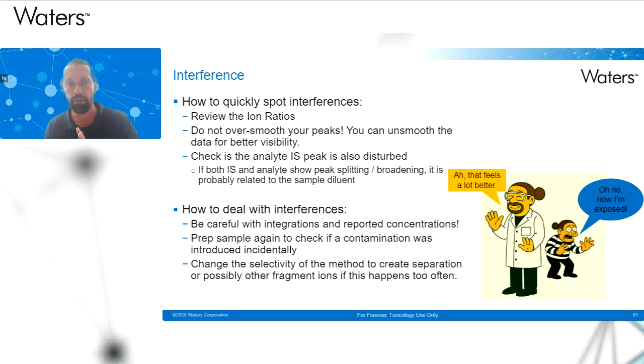So how can we deal with this? What we saw in the previous slide is that the internal standard was actually looking very nice. So it's always good to also compare the peak shape of your analyte with the peak shape of your internal standard. But then if we do observe it, how do we deal with this? Well, like I said, be careful with your integrations because you might report a too high value.